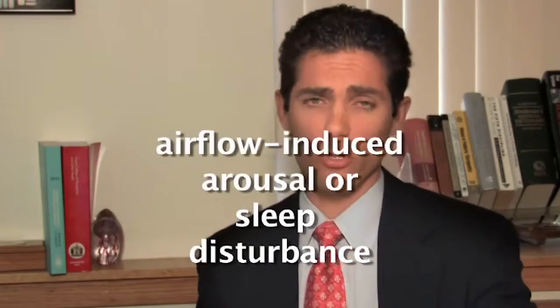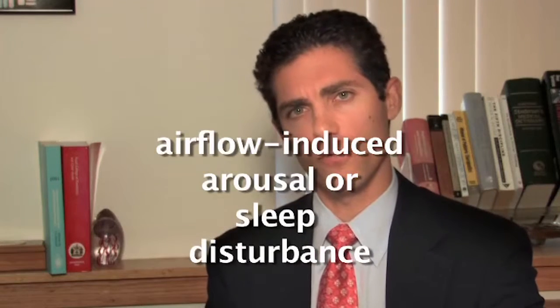Airflow-induced arousal or sleep disturbance. This is more of an issue for long-term patients on non-invasive ventilation, but certainly in a critically ill patient who's agitated because of the BiPAP, this is not necessarily tenable either.